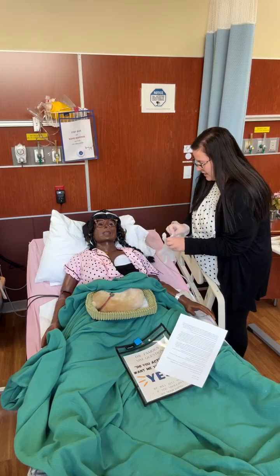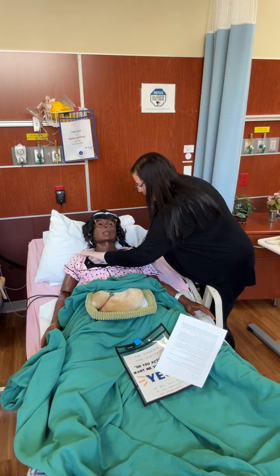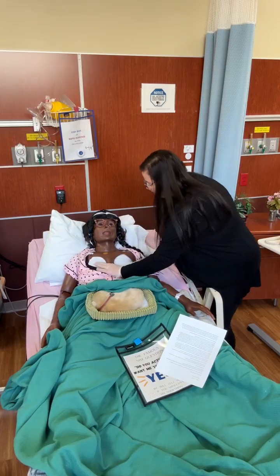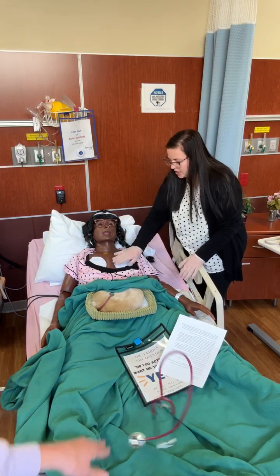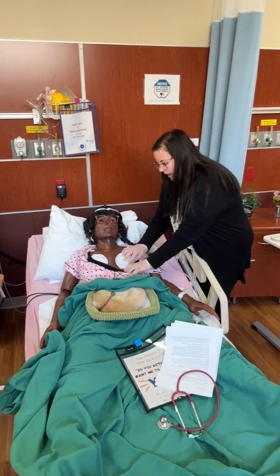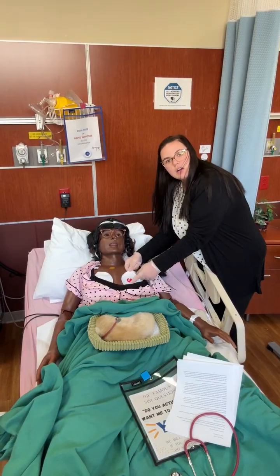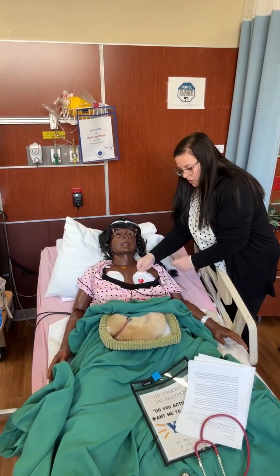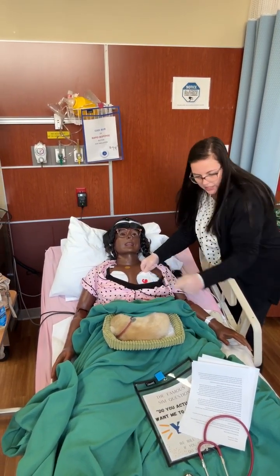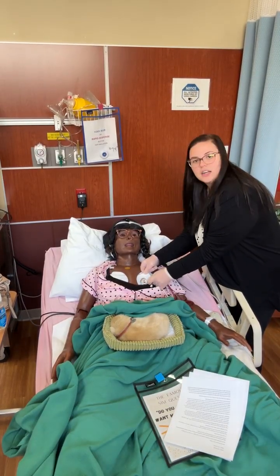And then, like I talked about, you're going to go through those landmarks. And if you notice here, because of the simulator, she has this white fabric. And down below, you will find a red sticker. When you're ready to get that apical heart tone, this red sticker is where you're going to want to place the stethoscope to hear the best.